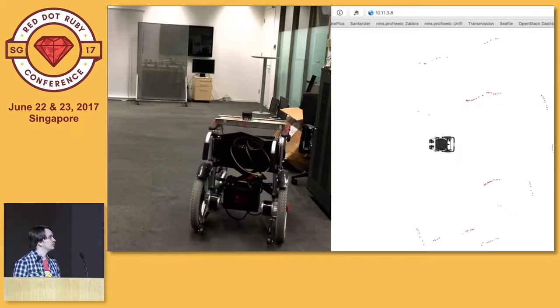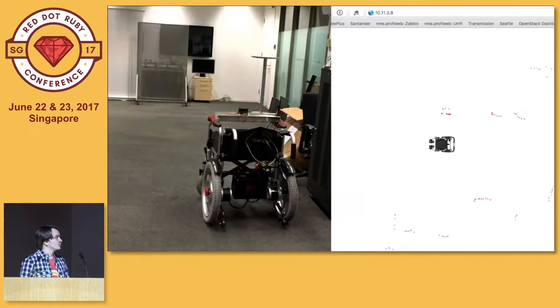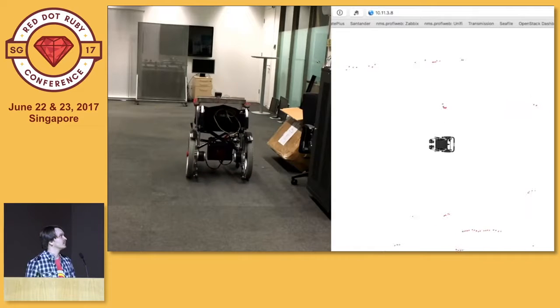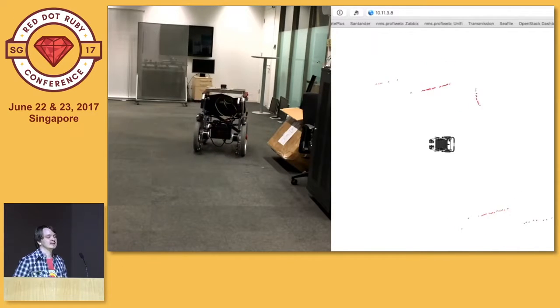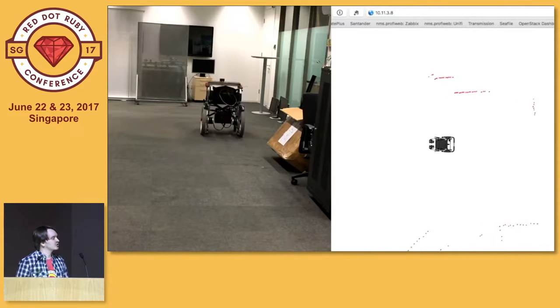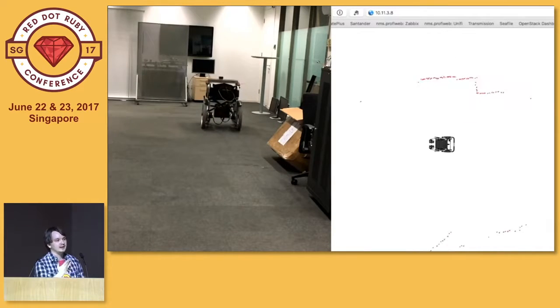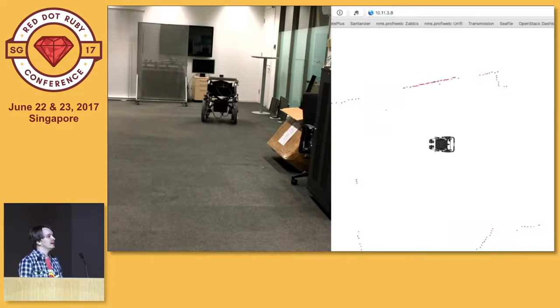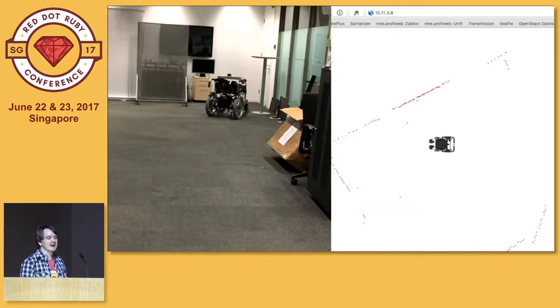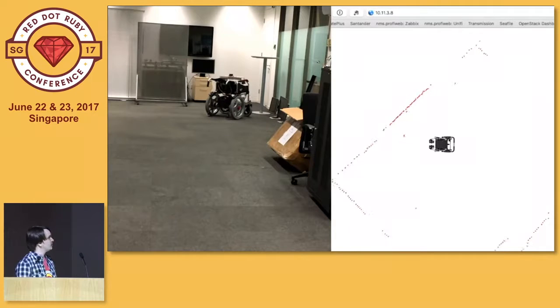If you're driving around, you also would like to not collide with other objects, so you need to have some kind of vision, which is the same system, just a different use case. You can see there are some things you cannot really see, like things which are reflective or see-through, but in the real environment it works quite well if you just estimate a little bit conservative and better stop than proceed.